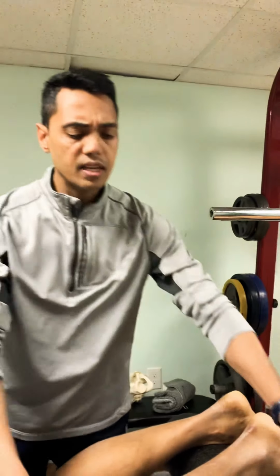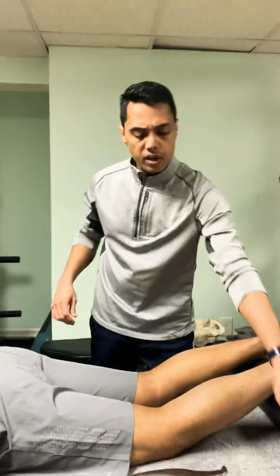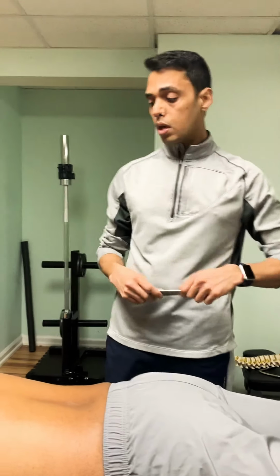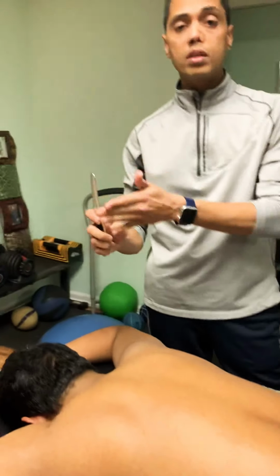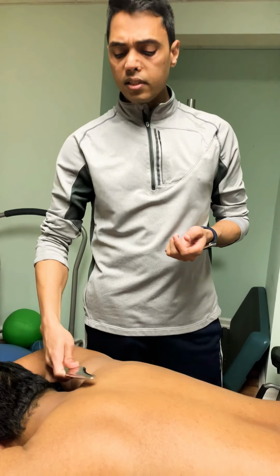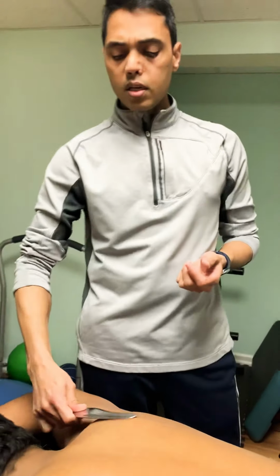So I'm going to use this as an example for a patient who's coming to me for neck pain. For neck pain, I would have completed the assessment. I would have done the functional movement assessment, which you'd also see in one of our videos. But I would use different pressure based on the contour. First, I would use concavities with very light pressure for pain. As you can see, the flatter and more parallel I am, I can use this for pain. The intensity is very low and the pressure is less than about 5 grams.